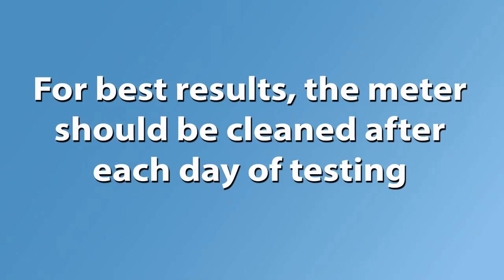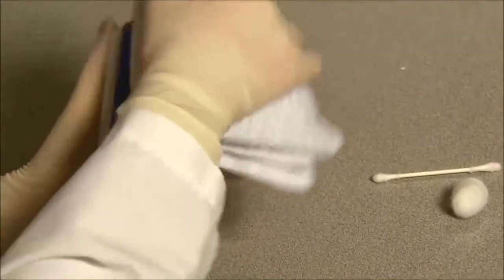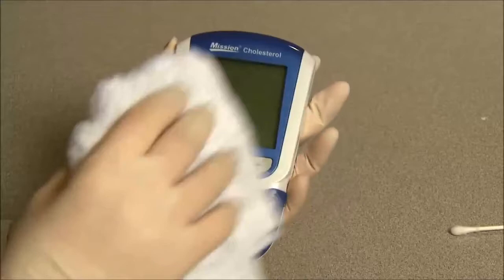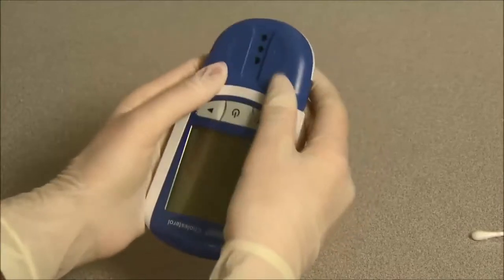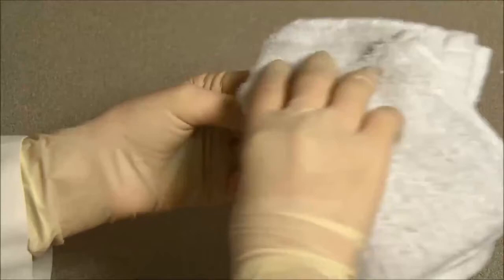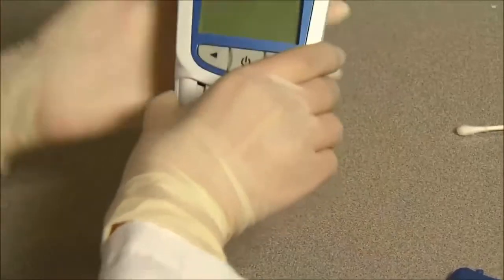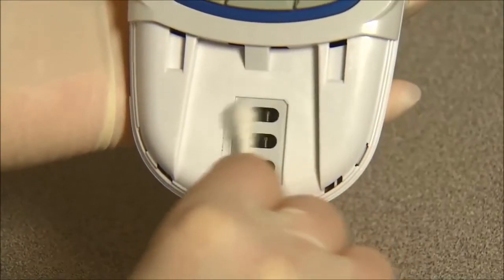Maintenance. For best results, the meter should be cleaned after each day of testing. Clean the meter surface with a dry or damp cotton cloth. Use a dry soft cloth to clean the LCD. Never spray any cleaning solution directly on the meter. Remove the test device holder by pressing in on the middle of the holder and sliding it out from the meter. Wipe it down with a damp cloth or mild detergent and dry it with a dry soft cloth. Wipe down the meter sensor area with a cotton swab, making sure not to scratch the transparent window covering the sensors.